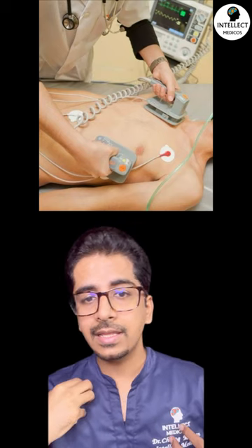Take out the external paddle from the defibrillator, apply some jelly onto it, and place those paddles onto the patient's bare chest — one below the right clavicle and the other just lateral to the left nipple.